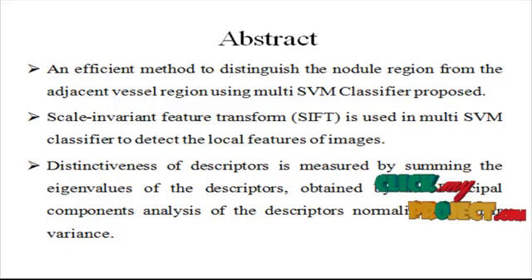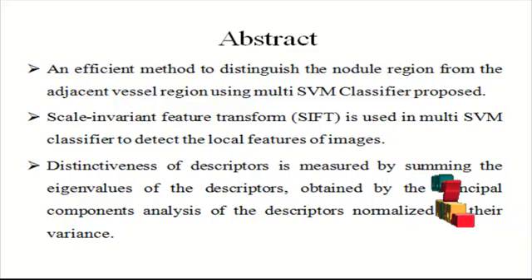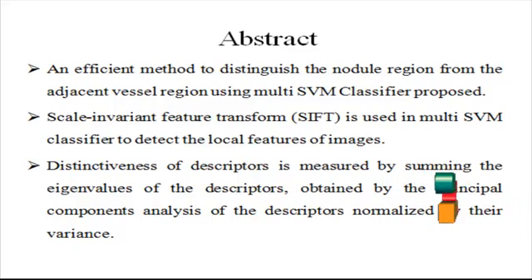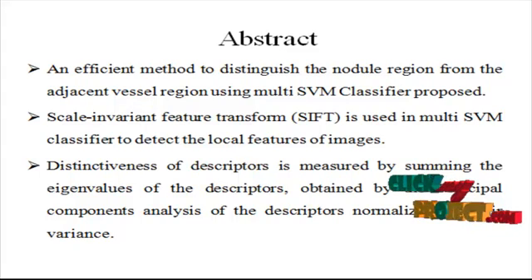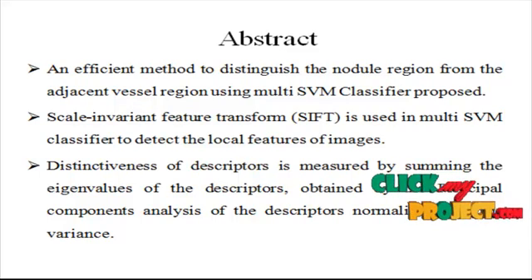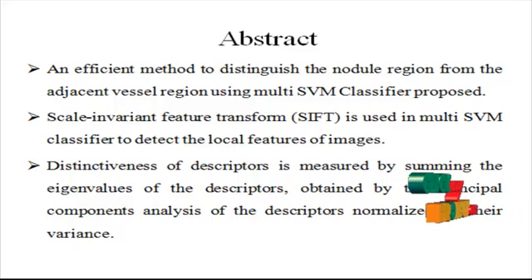In order to detect lung cancer early, efforts are underway to establish lung screening programs using multi-detector computed tomography rather than traditional radiographs. Distinguishing malignant pulmonary nodules from benign ones is one of the main challenges for lung cancer diagnosis, but it is usually difficult to achieve even with CT examinations.